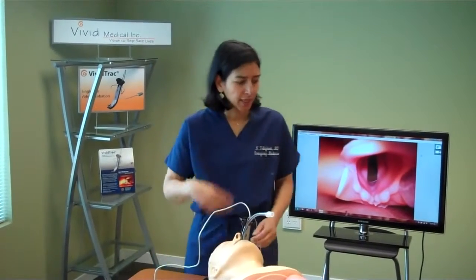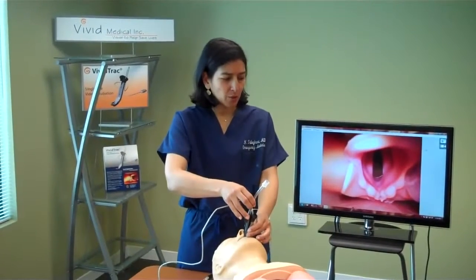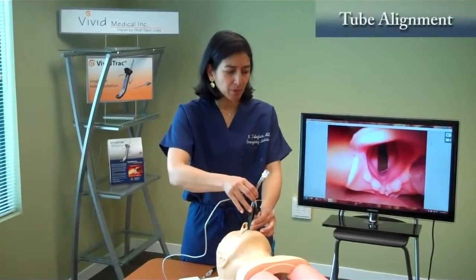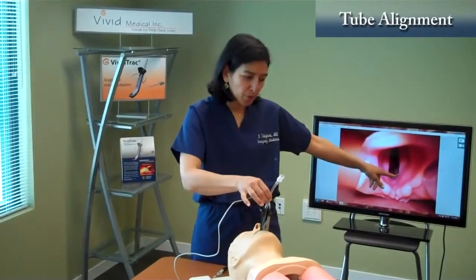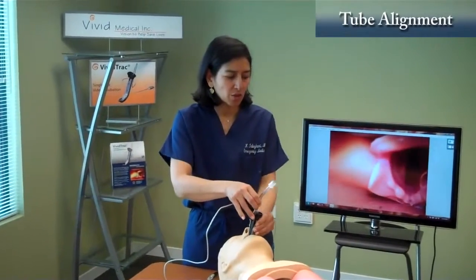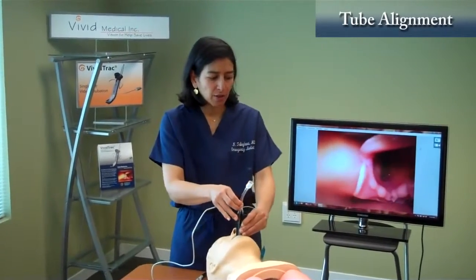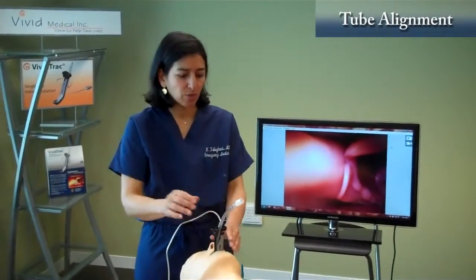A third pearl is when you have intubated and you are about to enter the cords, some people, you see the edge of my ET tube here? Some people like to actually push that in so they can see where they are and give themselves position to be able to get into a better position before they intubate. And that's another pearl, is that you can move that around.